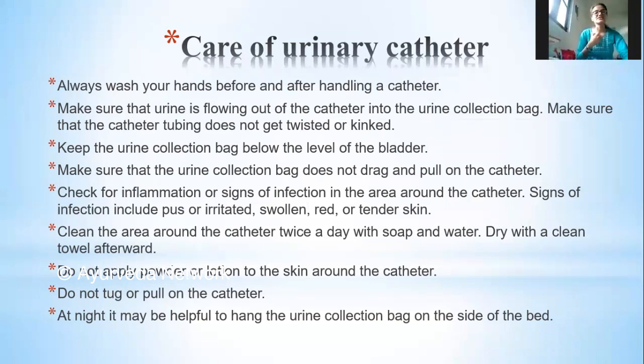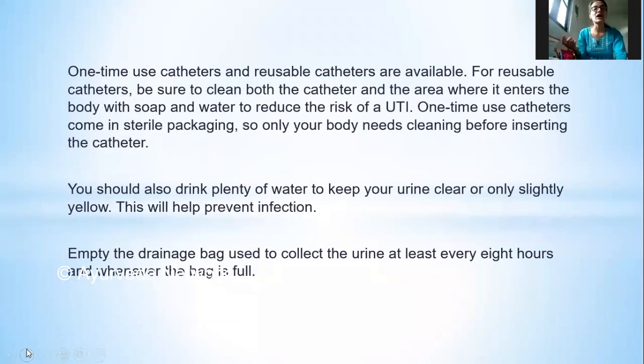So these are certain important things which you need to take care of, and of course cleaning of the catheter is necessary. And in the next slide you'll also understand how you actually remove the catheter and what care you should take while removing the catheter.